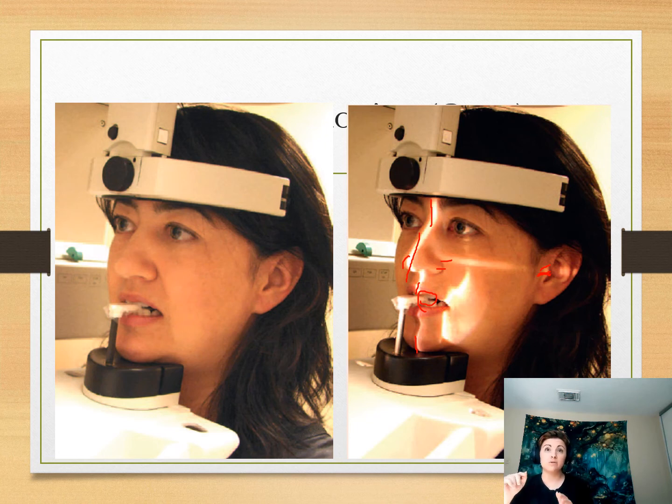If you try to line up the bottom of her orbit, which is somewhere between here, well, I guess that's a little high, is right there, and where you think the bottom of her orbit actually is based on bones, which is somewhere down here, and then her external auditory meatus, that's the hole that's somewhere in here. So you're trying to line up some of this with something in this. It is very not exact. I hate it. It's vague. So ala-tragus. Line those up. You'll get it right every time.